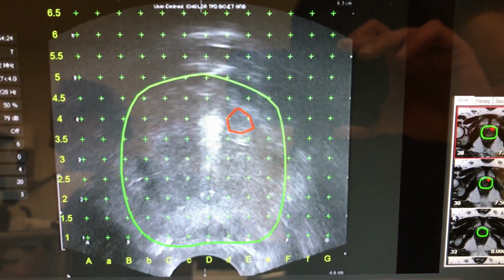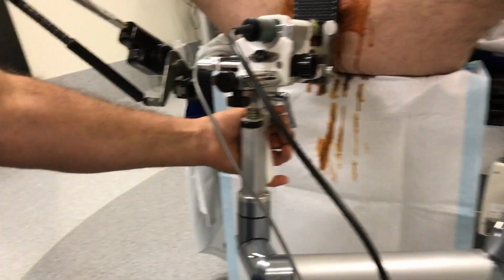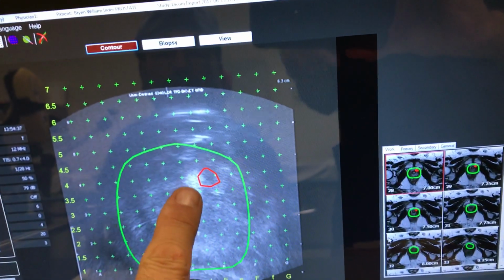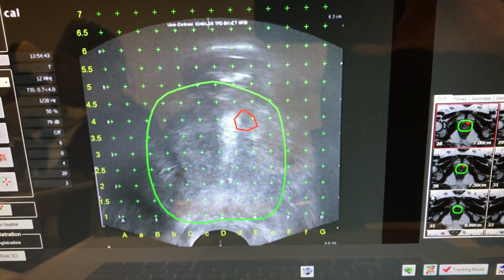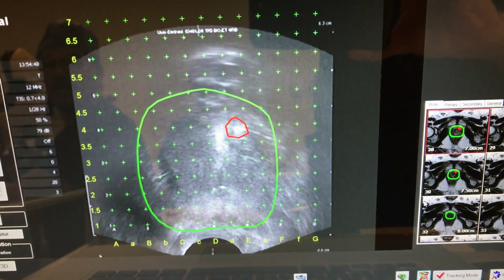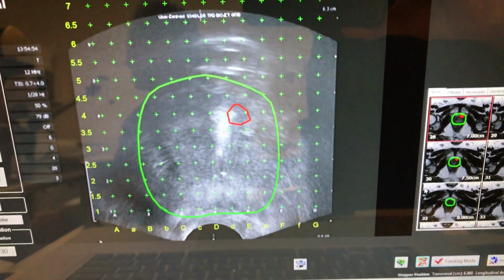So what I'm going to do now, I'm going to move this off center, so that I can go in one of the existing spots and still get the black spot. Now it's moved closer to the big E4 mark. So this time I'm going to go into big E4 again, but I've moved the whole template across, and then you can see I'm smack in the middle of it, and I've got the middle sample, and that's how you do it.